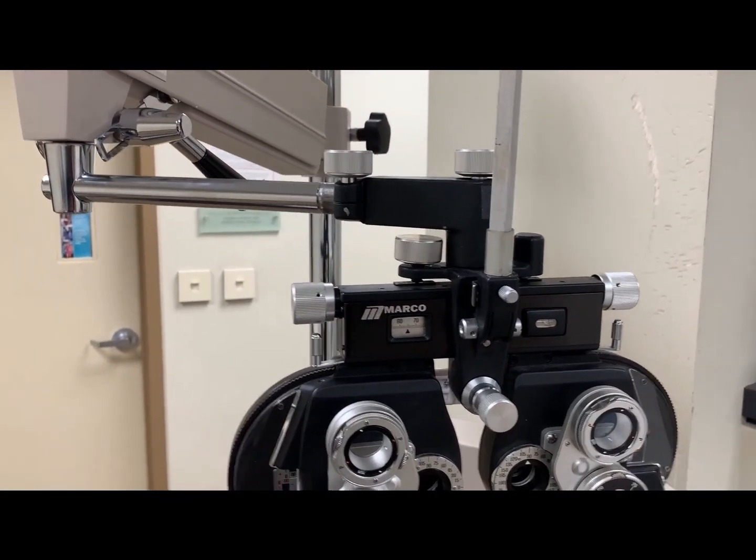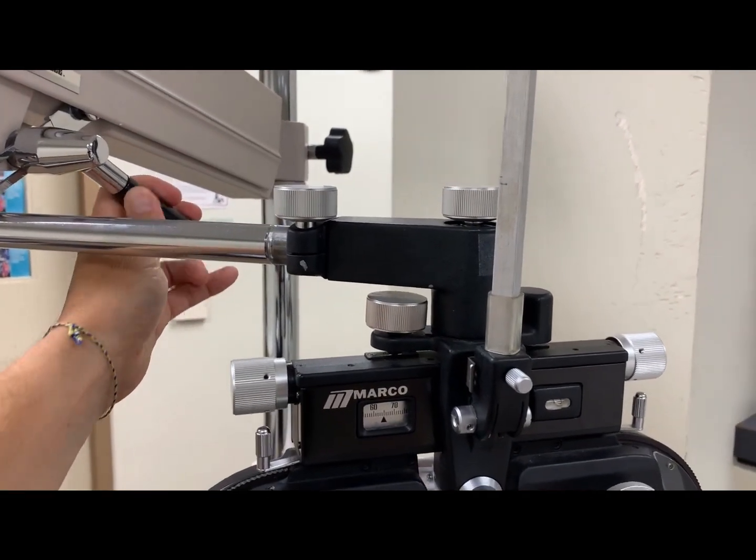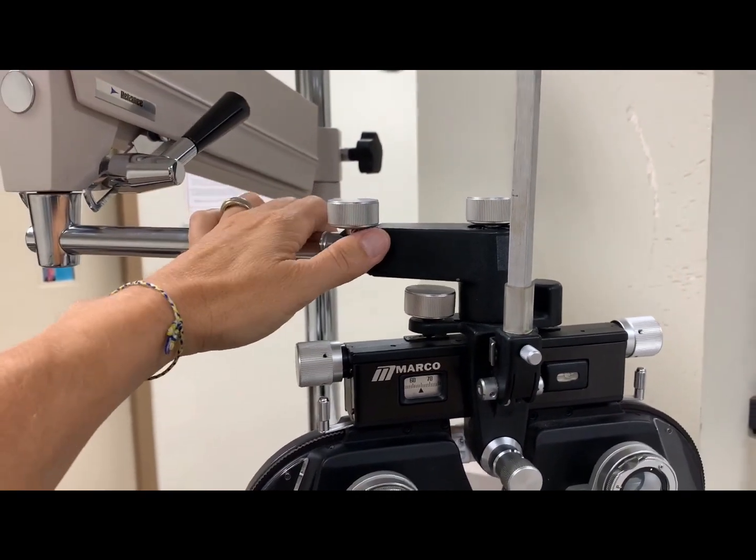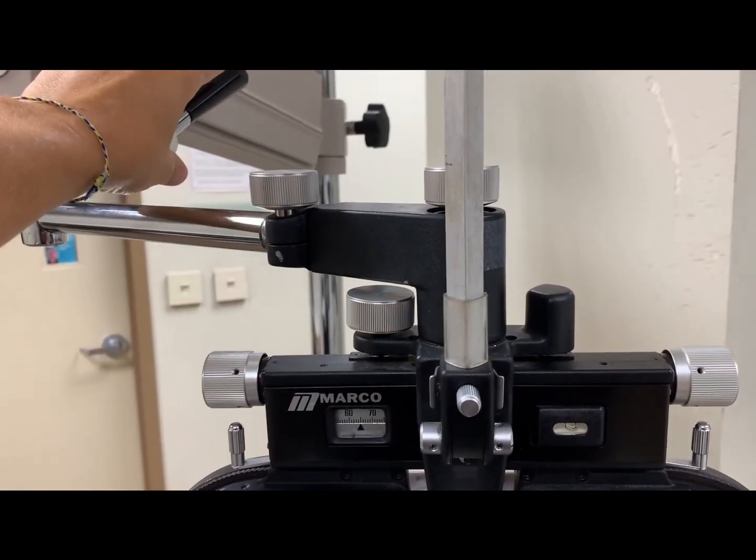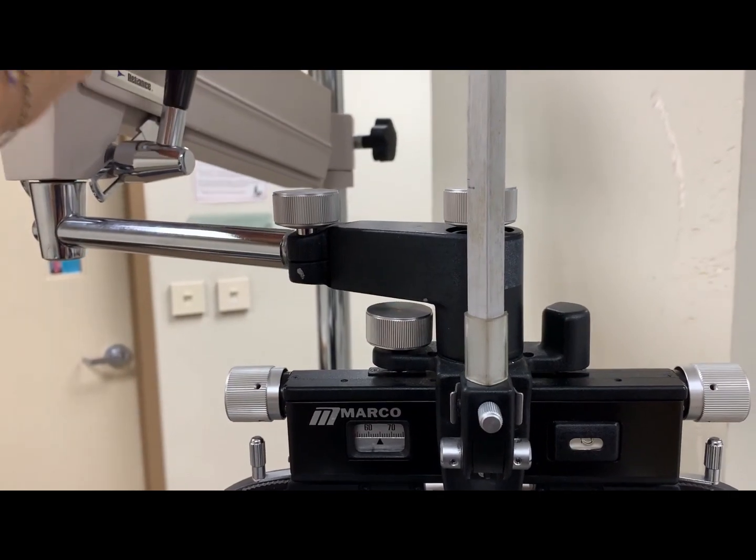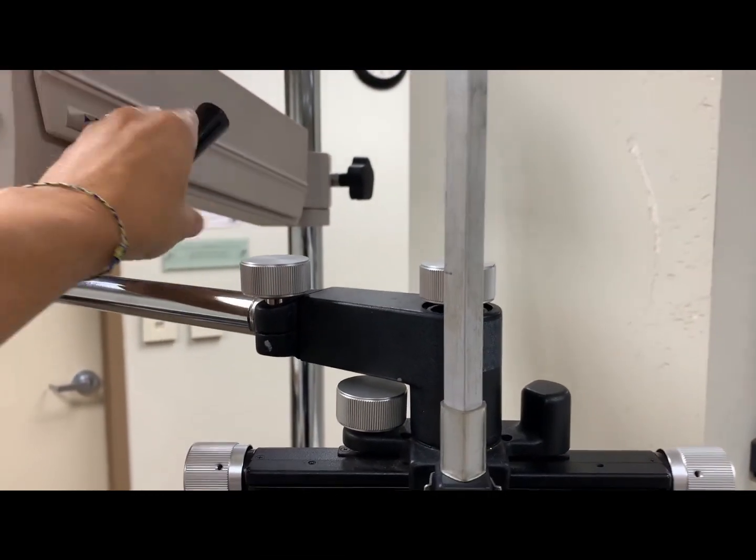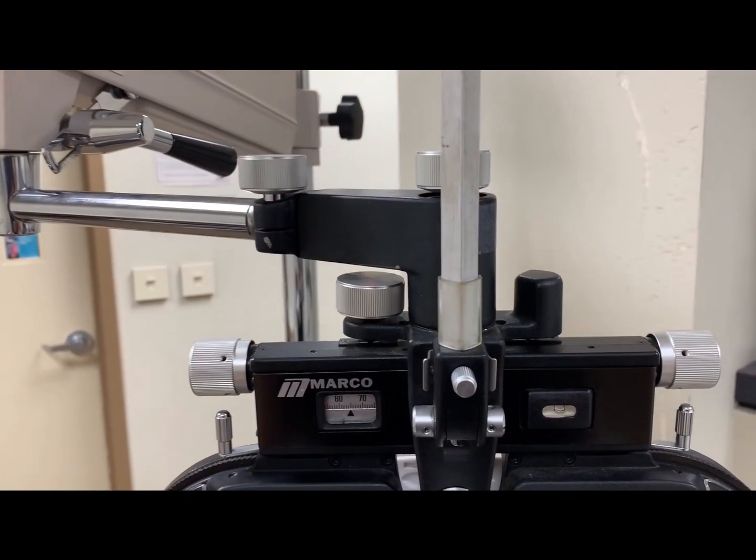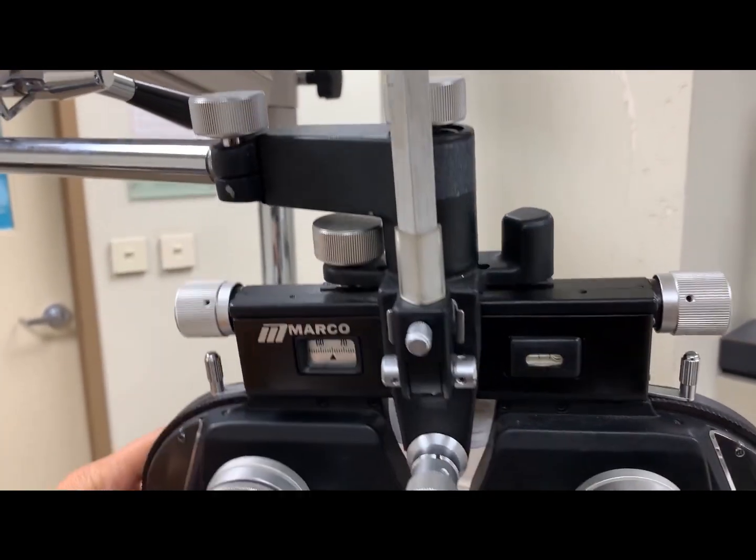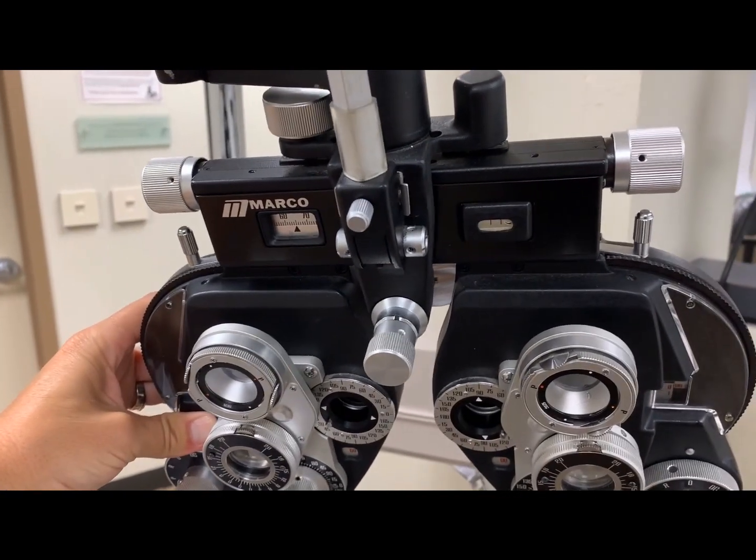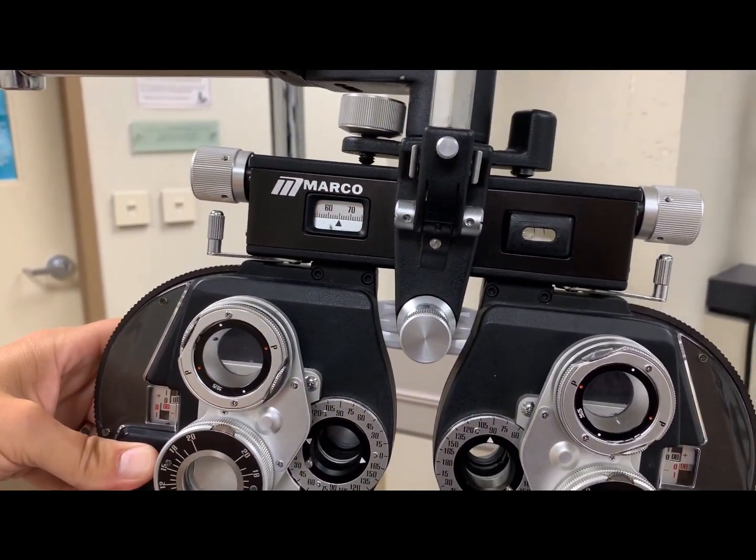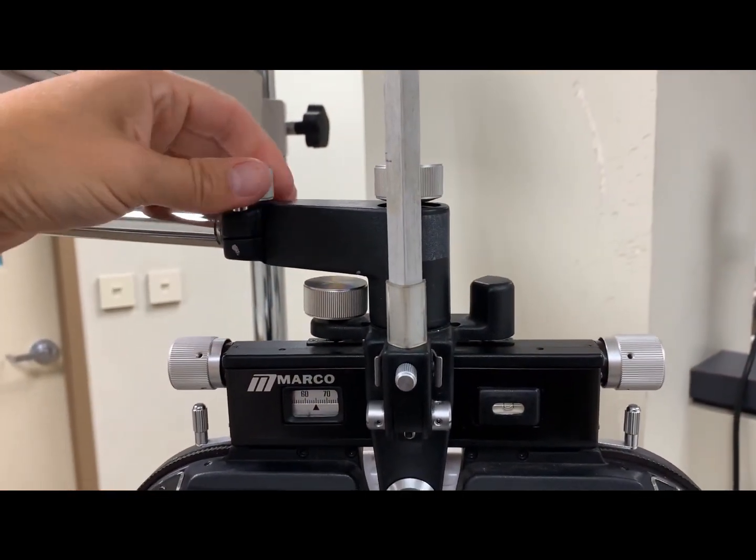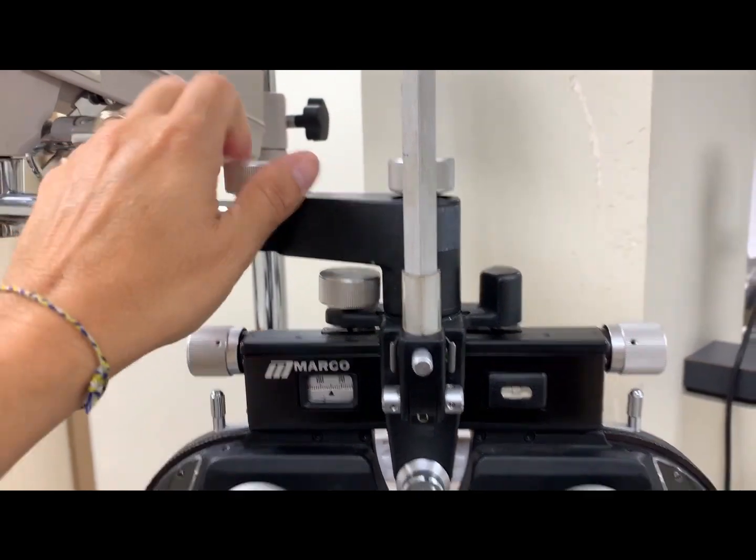First of all, covering the lock knobs. The initial lock knob here on the arm is going to release the phoropter and allow it to swing in front of your patient. Always make sure that the lock knob is unlocked prior to moving the instrument. Next, you've got a lock knob here. This, by loosening it, will allow you to increase the panto of the phoropter, pushing you closer to the patient, or to increase the retro on the phoropter, bringing it away from the patient. Always make sure that this lock knob is tightened as you begin your sequence.